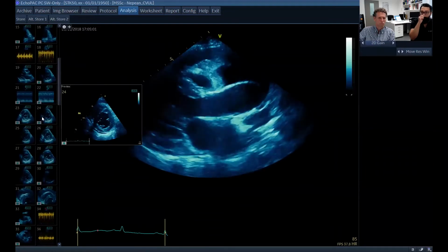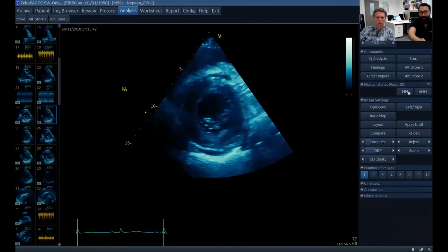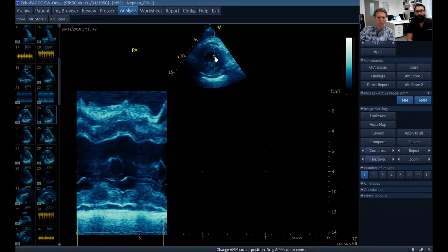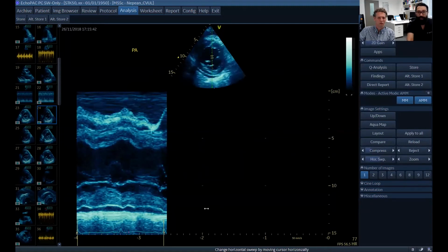And you can use M mode to help get a better temporal resolution. So this is using something called anatomical M mode. And this is very elegant because if you have a look at your M mode representation, you are getting buckling and compression of your right ventricle. And often you also see this in the outflow tract of the right ventricle in the parasternal long axis views as well. Similarly, for chamber collapse of the right atrium, it tends to be when those pressures are the lowest, and that is systole. So you're looking for diastolic right ventricular collapse and systolic right atrial collapse.